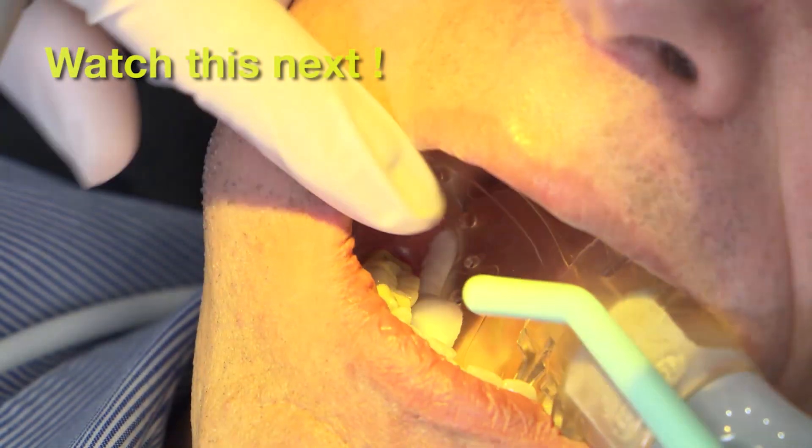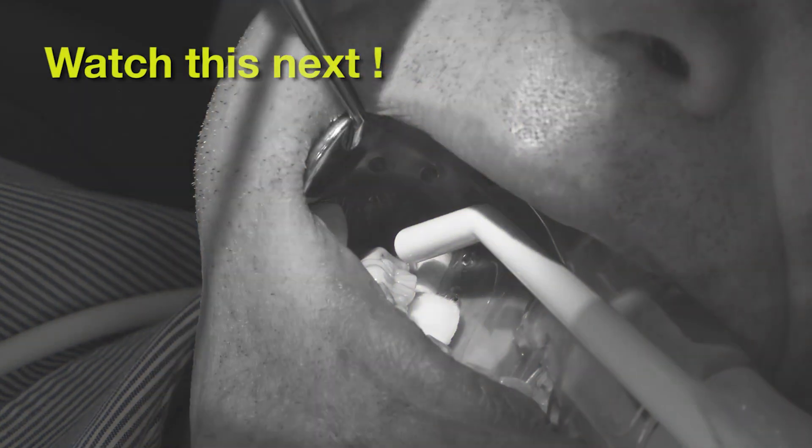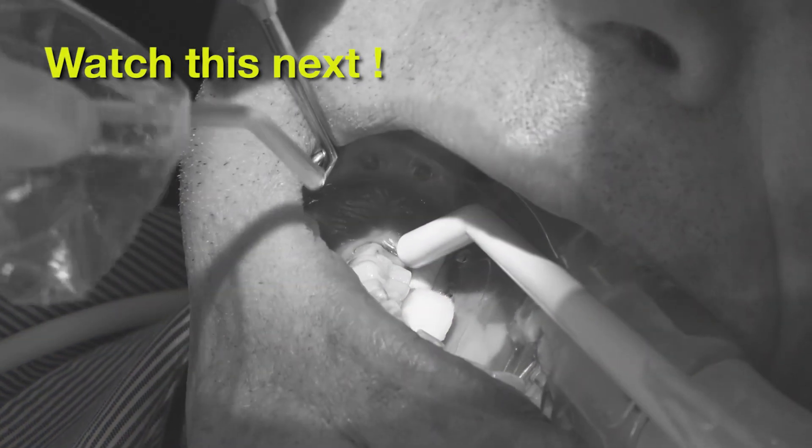Once we apply the bonding agent, we'll aspirate some of the excess using a smaller surgical suction.